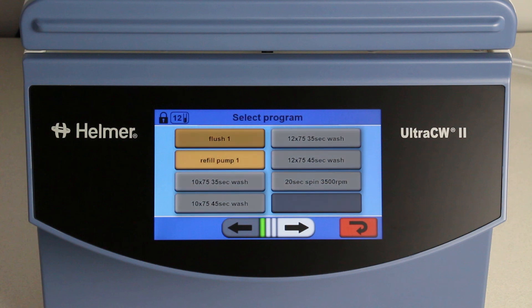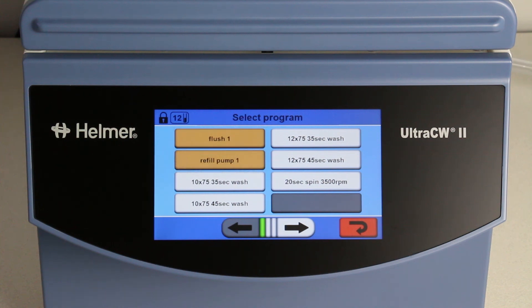The flush and refill pump programs are system programs and therefore cannot be changed or deleted. The four wash programs and the spin program are user programs and can be edited if adjustments are needed to meet your facility's needs.